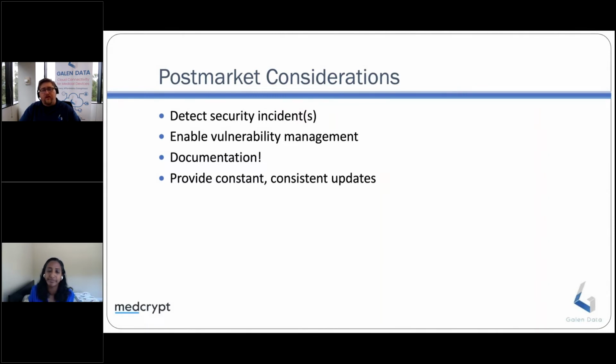You know, that's a relatively new concept for healthcare devices. It's been around for quite a while in the IT field, but they are expecting you to do a threat model for every scenario where that device can exist. So if it's going home, all right, what does it look like in the home environment? Who can attack it? Can you depend on it being behind some kind of firewall, or how is it communicating?